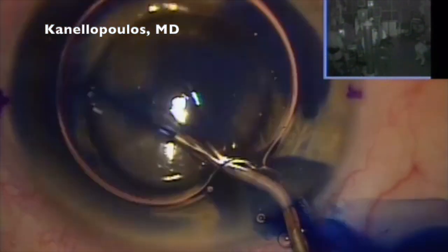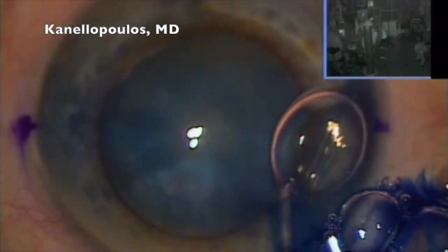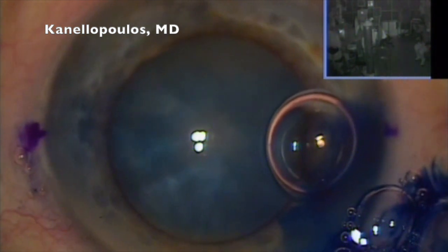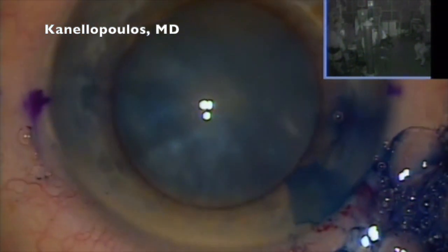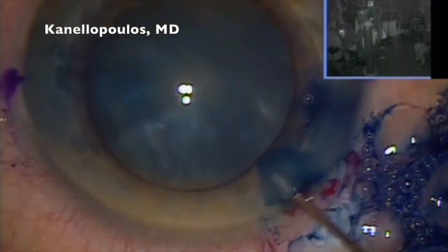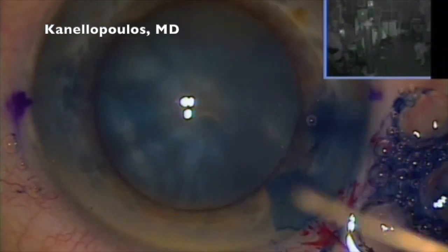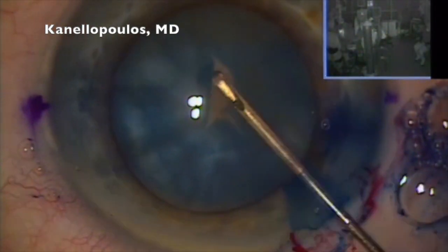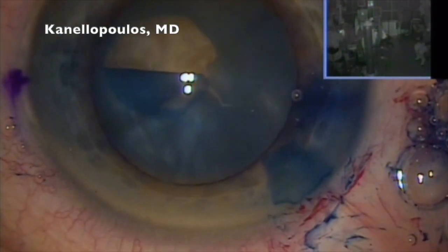I'm using epi. The pupil does not move. Air, you guessed it, blue. And I'm going to come in with a 30 gauge needle initially because I'm afraid the lens is intumescent. So I will incise the anterior capsule with a very tiny incision, and without a paracentesis, there's no leakage of cataract milk. So obviously this was not an intumescent lens, just a white lens.